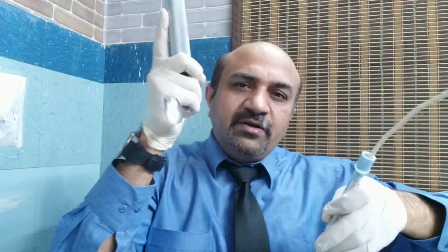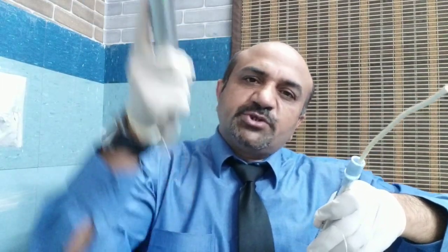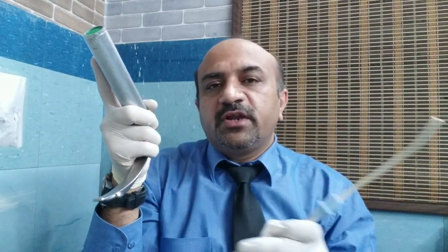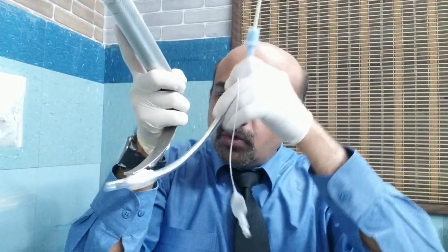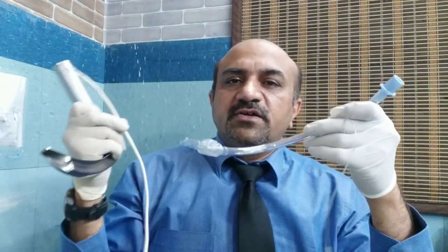You pull the tongue to the left side, and by looking at the tracheal opening, you go inside the trachea, and once you are there, you remove the stylet.